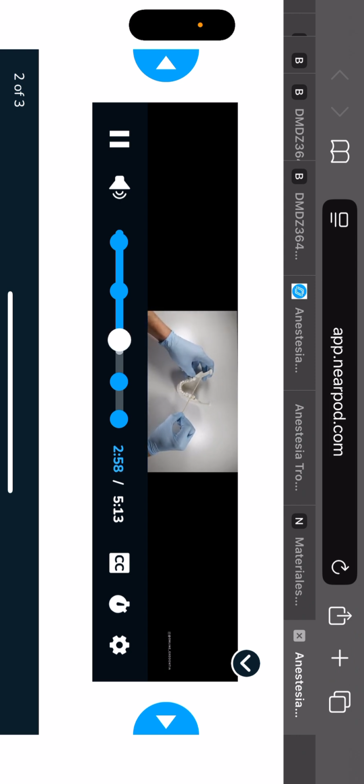Now, when you see that, another tip is you want to aim a little bit more posteriorly. And when you aim a little bit more posteriorly, it's going to give you a better chance of hitting that nerve before it branches. So the branching can be difficult to locate on a pan in reference to your anatomy when you're injecting, so aiming posteriorly is just a safe way to go.